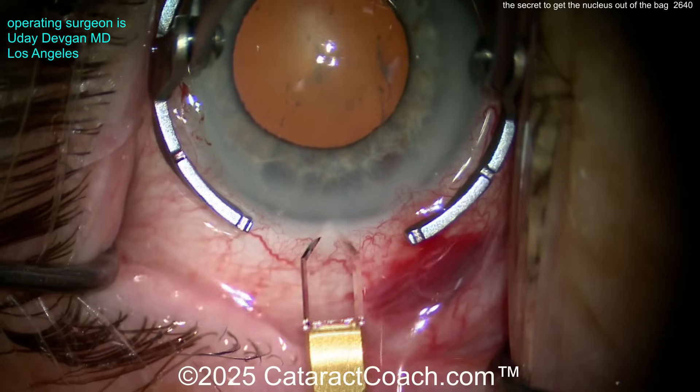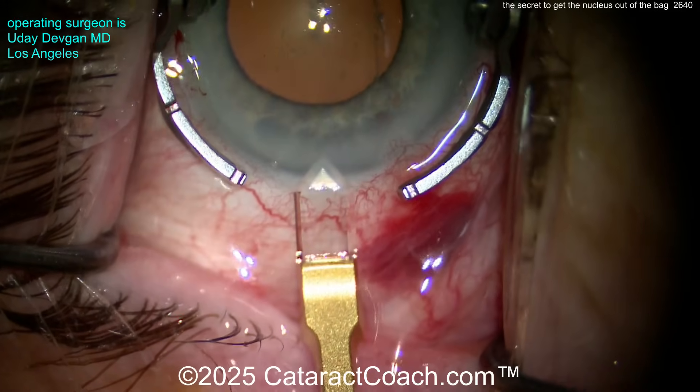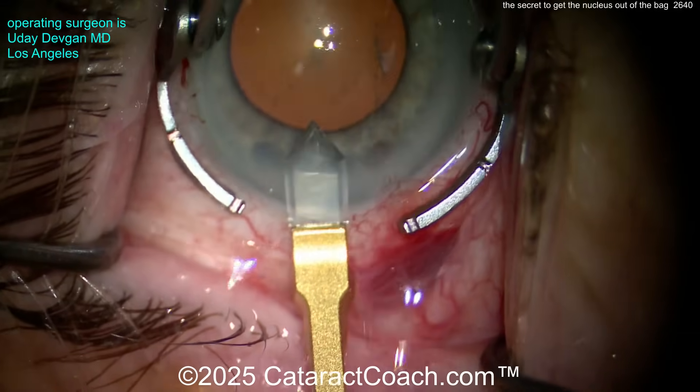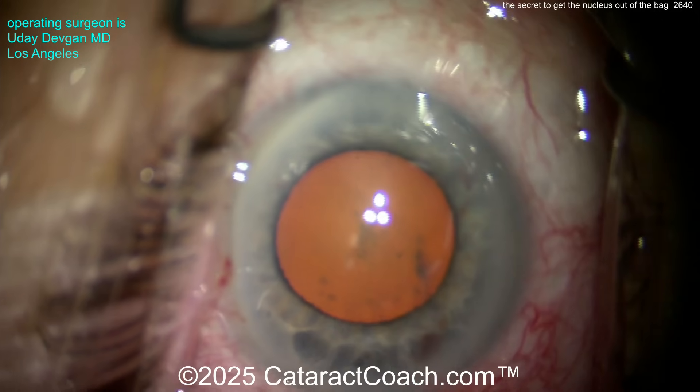This is a complete cataract case shown start to finish. Our young ophthalmologists love to see these unedited cases shown from the very beginning to the very end. So let me show you everything here — no edits in this video.